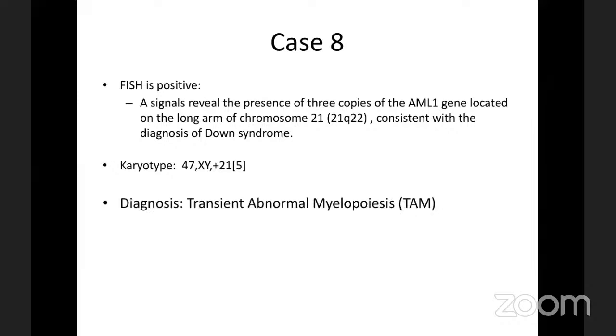So this patient was diagnosed as TAM. Unfortunately, he passed away after a few days. But the presentation is going with a TAM for Down syndrome.